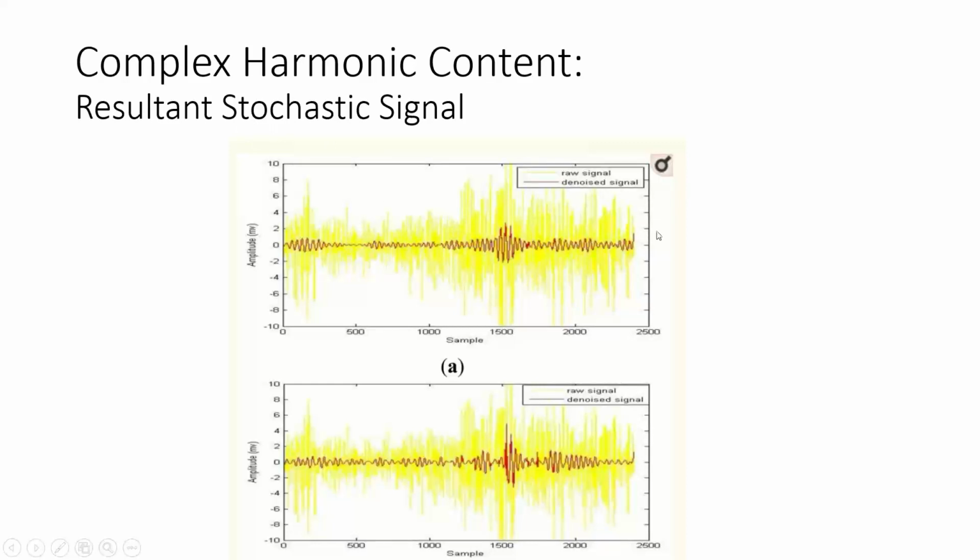So what we have here is some modern experimental techniques to quote unquote denoise the wave, get rid of the harmonic content, and try to get down to the fundamental waveforms. The yellow would be all that harmonic content and noise, and there's your fundamental. It gives you an idea of how much of what you're seeing when you see all this mushy mess, the fuzzy caterpillar on your trend screen, underneath it is kind of some sinusoids that are complex triphasic.